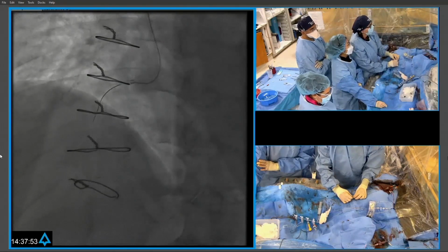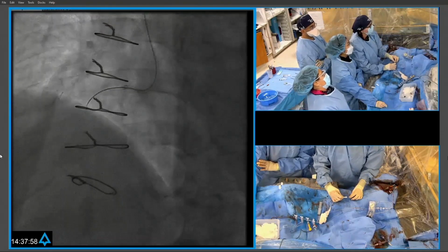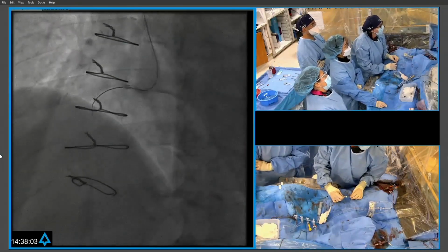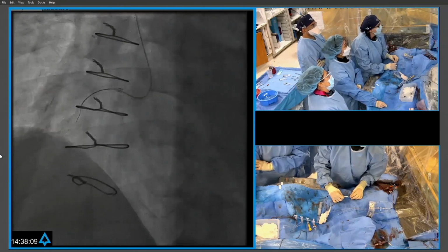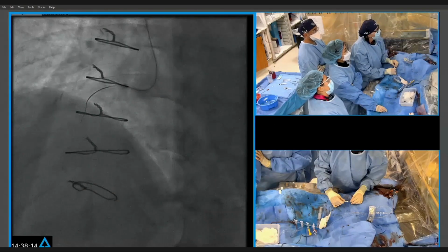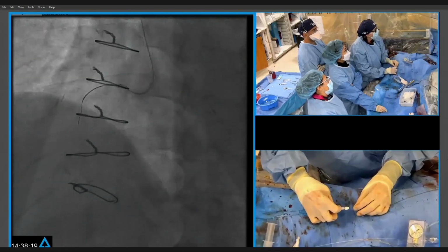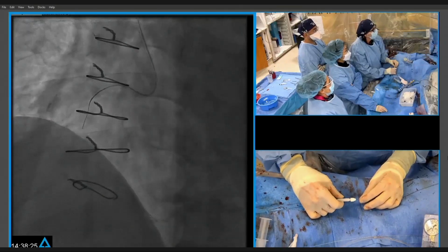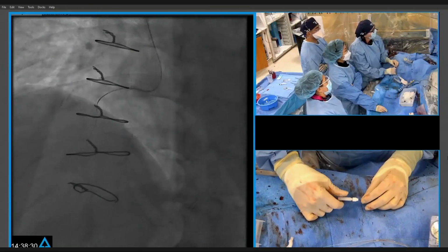And this is super important: microscopic movements, tiny, tiny adjustments, and working carefully so as to not extend that big extra plaque space. I can see she's really redirecting it in a slightly different direction than before. Yeah, I see it. Obviously, the wire is always going to want to track where you were, but sometimes with a different wire you get to pick up a different track. I think it looks a little different. Yeah, I think so. Another thing that can sometimes make this difficult is because there's disease downstream.